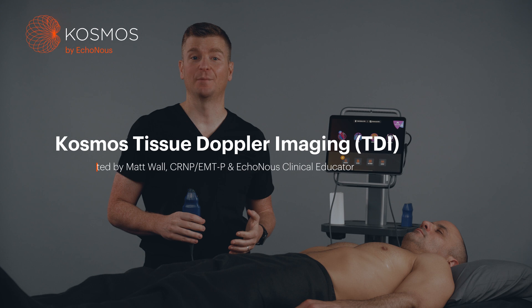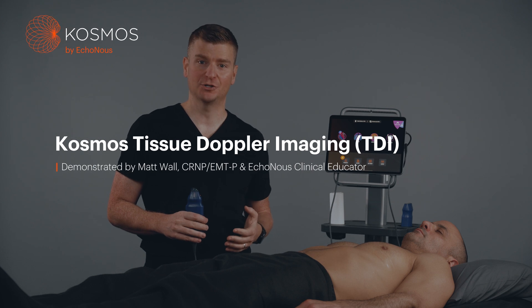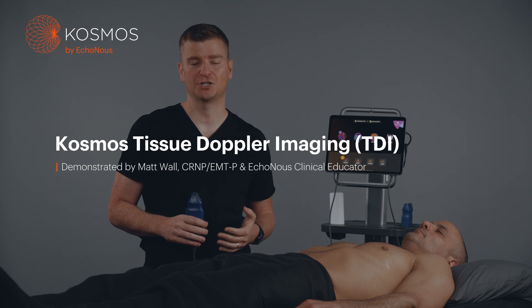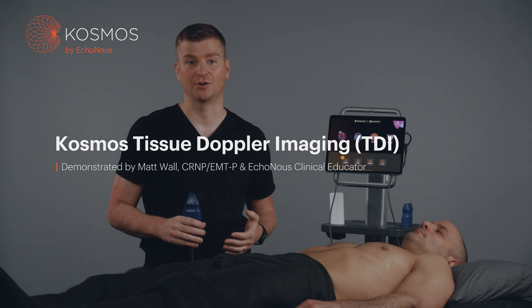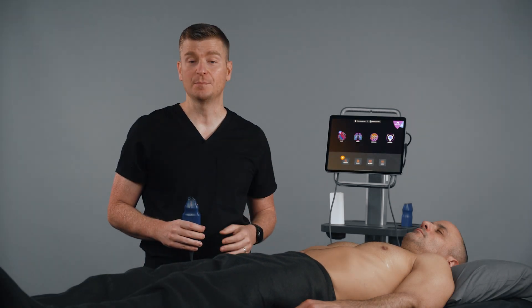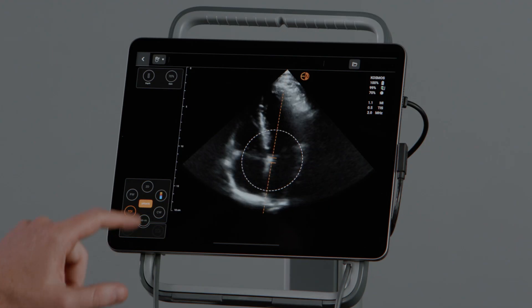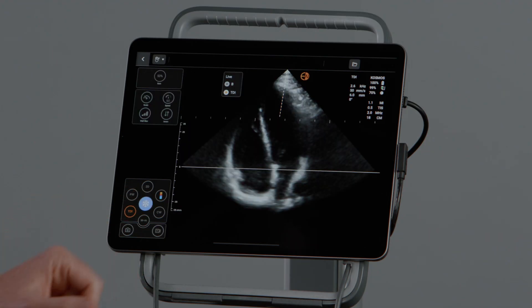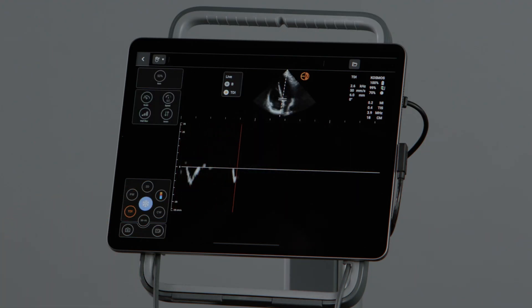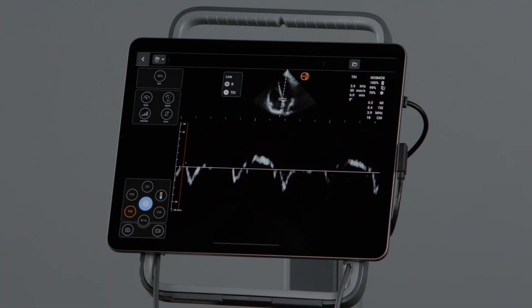Hi, my name is Matt. I'm a nurse practitioner and clinical educator here at Echinose. I'm going to show you how to use tissue Doppler imaging, often called TDI, on the Cosmos Torso One probe. Tissue Doppler imaging lets you measure myocardial tissue velocities during your cardiac exam.